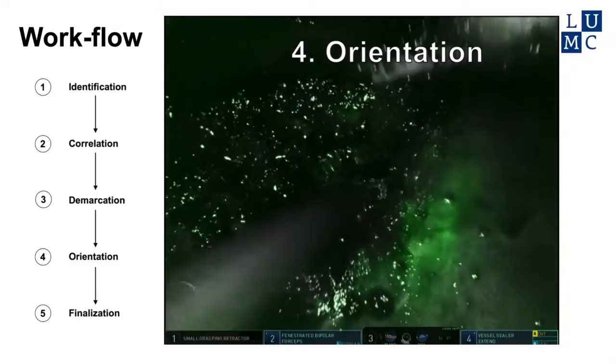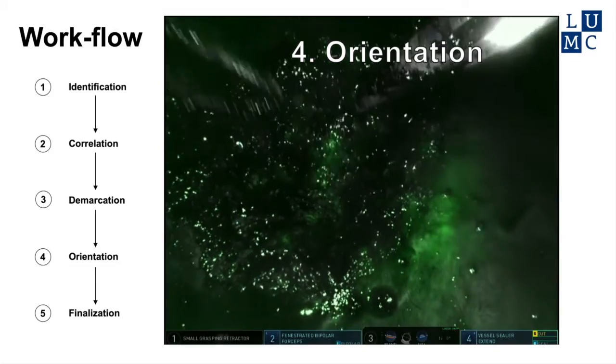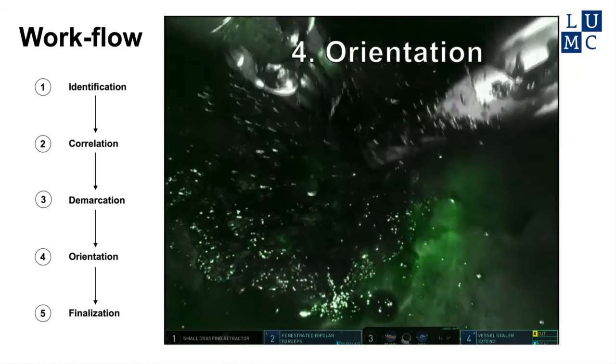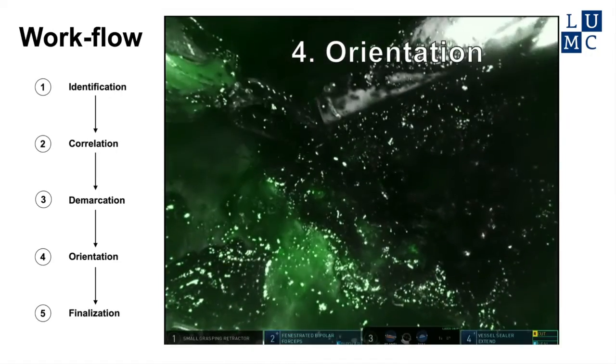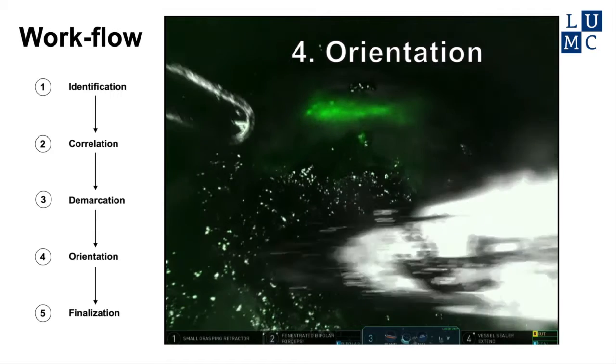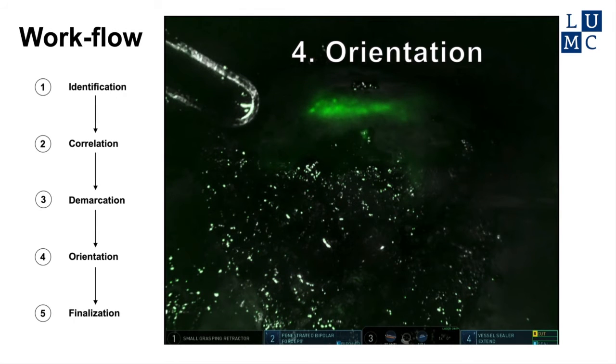During the actual resection, an inspection of the parenchyma for fluorescent signal is performed routinely. In this case, some fluorescent background signal is observed, but no protruding rim. The background signal is produced by low concentrations of ICG still present in the biliary tract. A difference between the fluorescent signal at the top produced by the rim and the parenchyma at the bottom is clearly present.